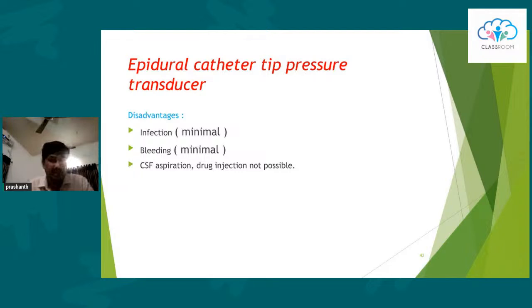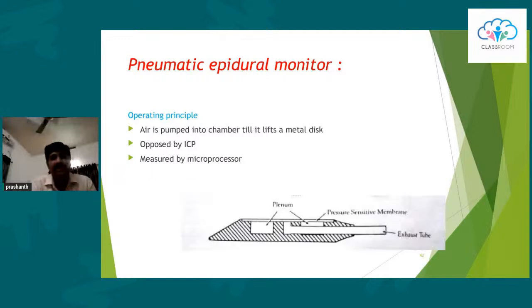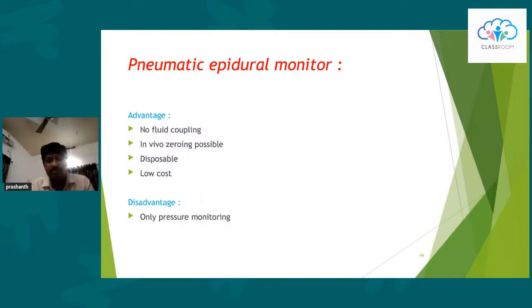This is a new technology where a fiber optic probe is placed intraparenchymally, and it can be used in other areas also, like epidural and subdural. But the best results are when you use it in the intraparenchymal location.